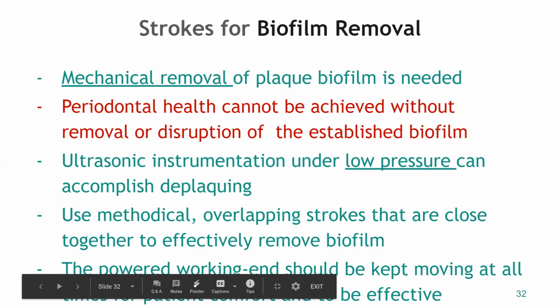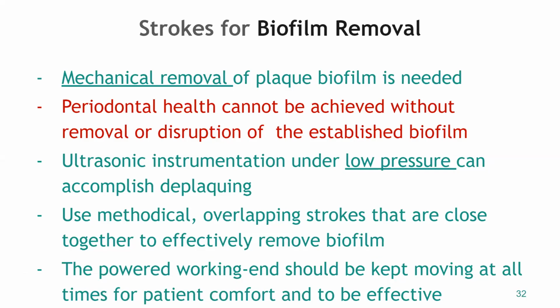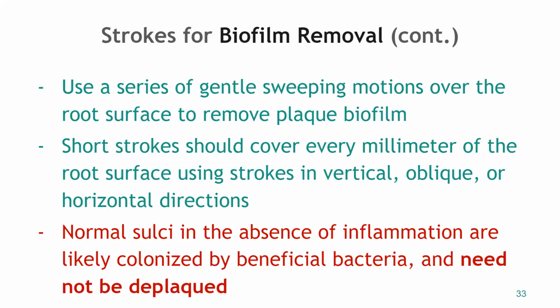And the working end should always be kept moving, okay? That's just for patient comfort and to be the most effective. We don't want to just set it on top of a piece and not move it. It's always got to be moving. We're going to use a series of gentle sweeping motions over the root surface to remove plaque biofilm. Short strokes should cover every millimeter of the root surface using strokes in vertical, oblique, or horizontal directions.